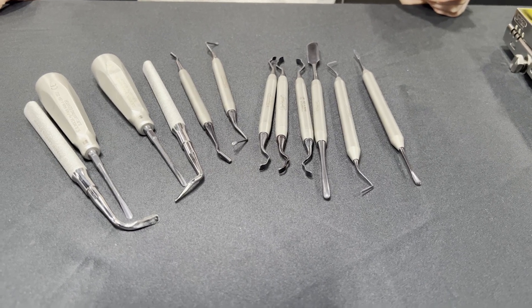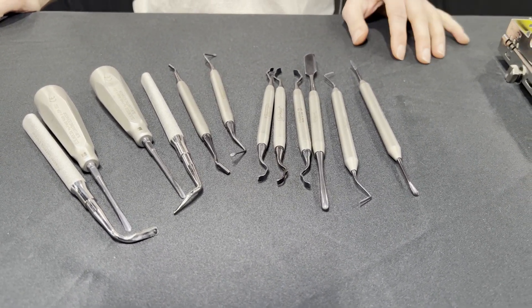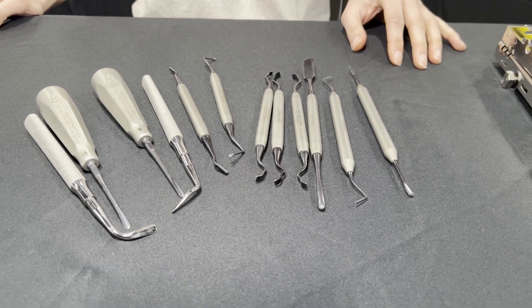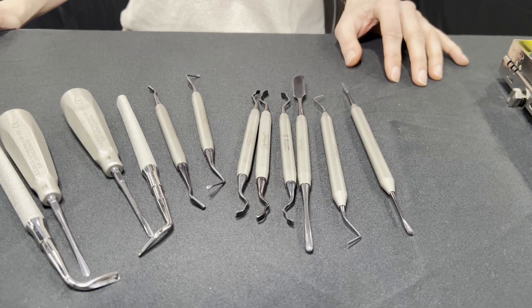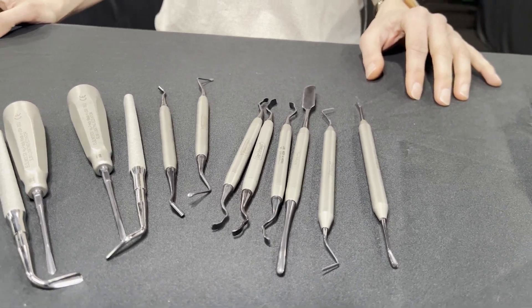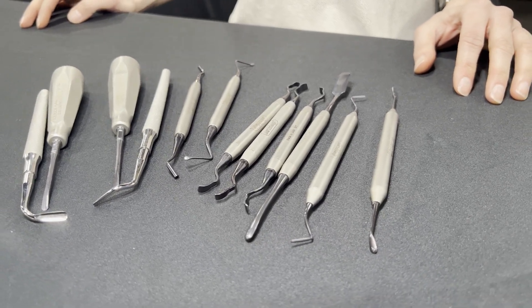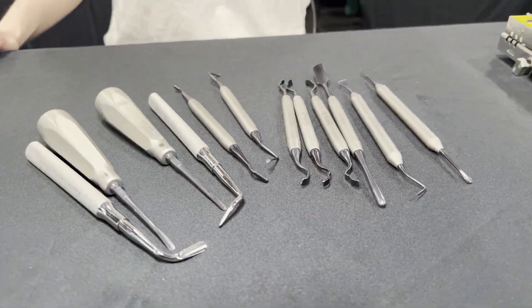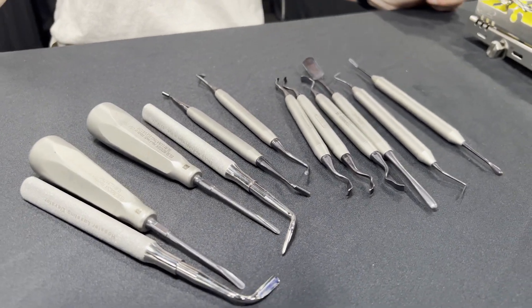Being able to actually see it when it's subgingival is another bonus. And the lubricity is great — no one likes to have clumpy stuff on their instruments. Clumpiness is something that we try to avoid. No one wants to have those little rocks coming out of hygiene or out of the sterilizer — it's not good.